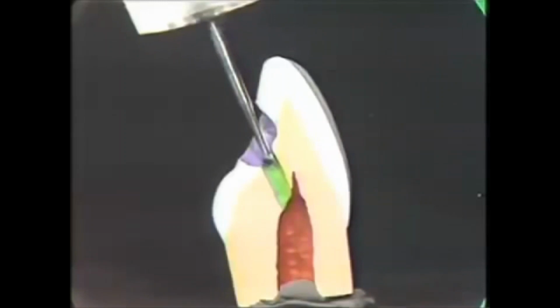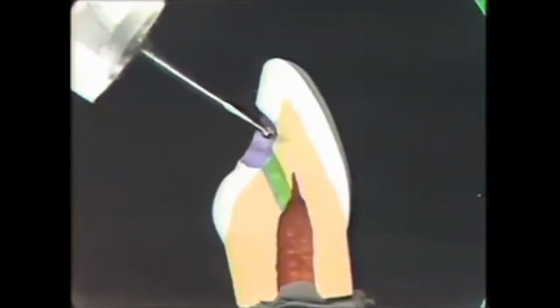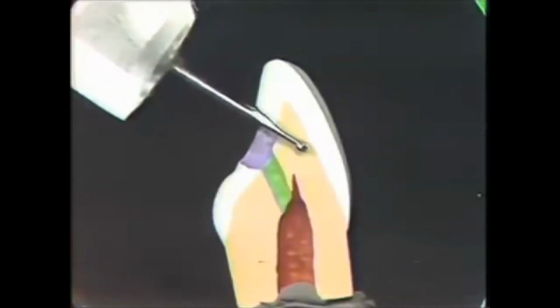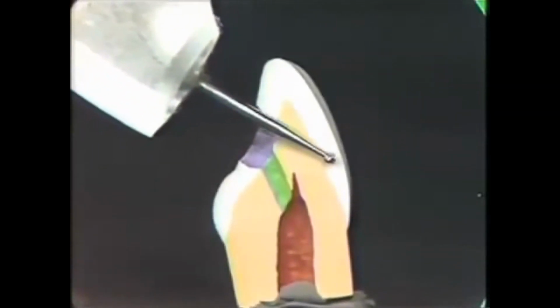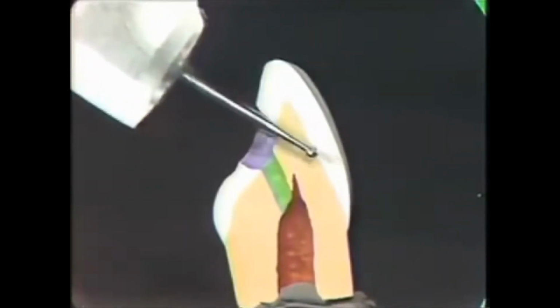Now, there are two ways where people get in trouble in this step. One is to start off in the wrong angulation. They keep it in the same angle that they kept the high speed, and they continue right out, miss the pulp, and go right out the front of the tooth. Now, patients don't like you drilling holes in their teeth while you're looking for the pulp, so make sure and check your angulation so that you're in the proper long axis of the tooth and go right on down.